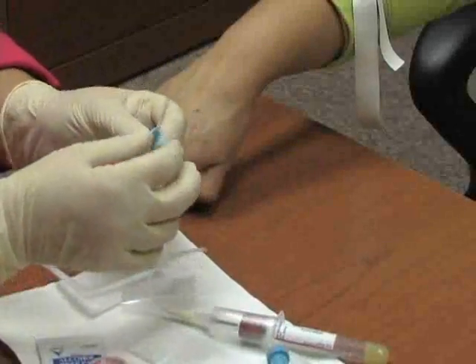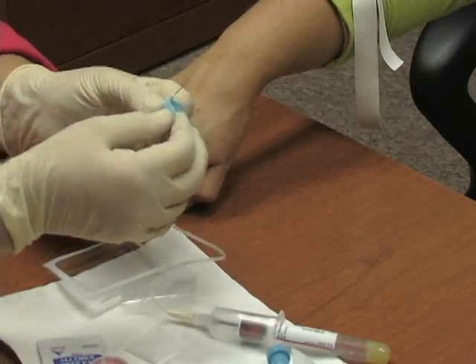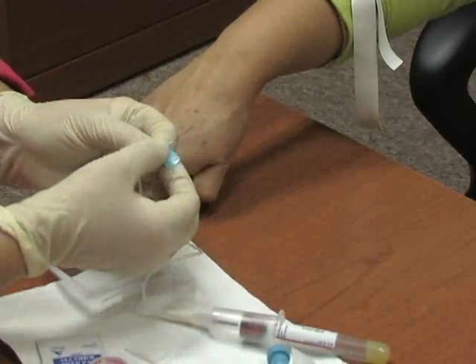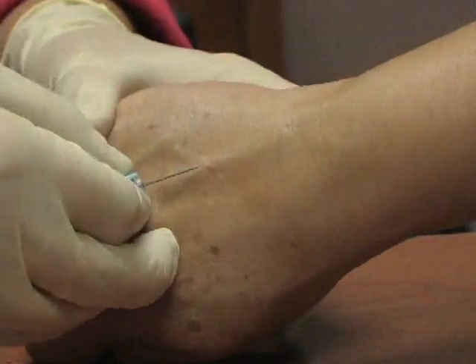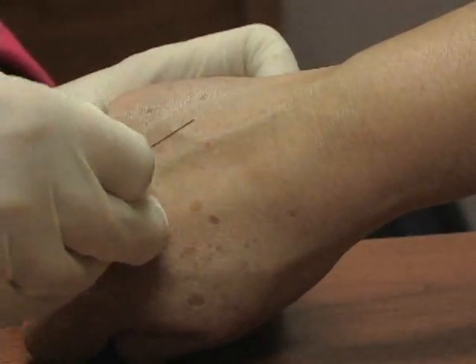When you pick up your butterfly needle, it's bevel up. Bevel up means you look at your needle and pull the tips of your butterfly up so you can easily manipulate them. You have your tube ready to go and get ready to insert the needle.